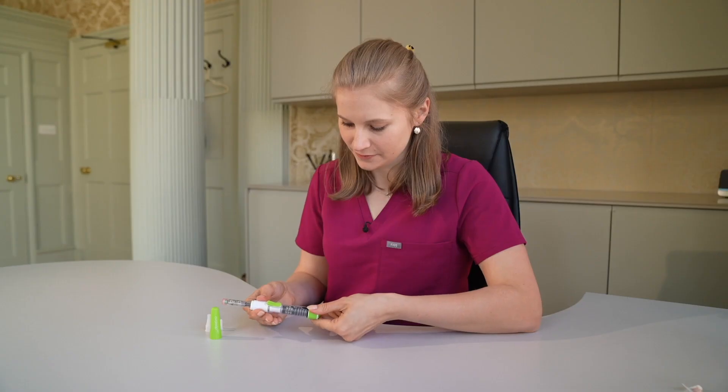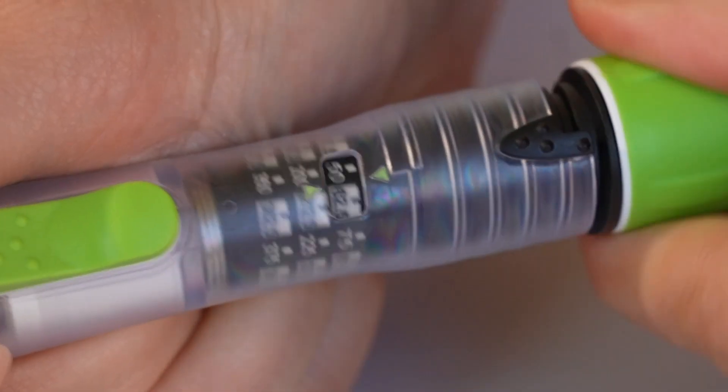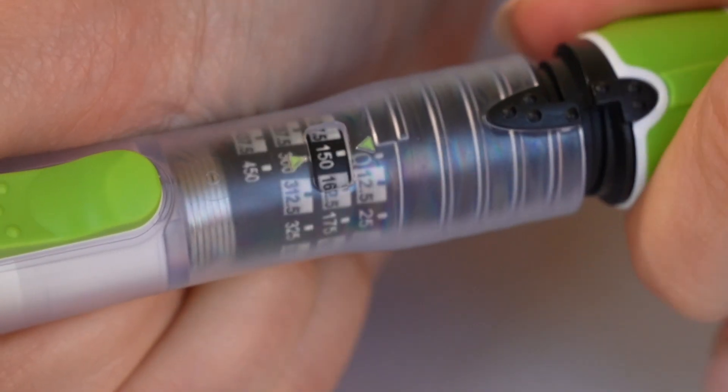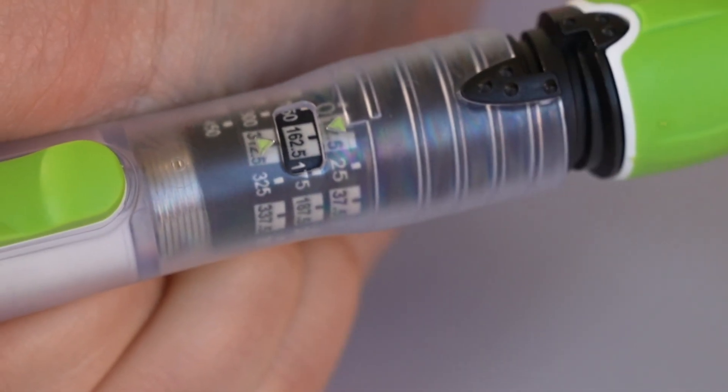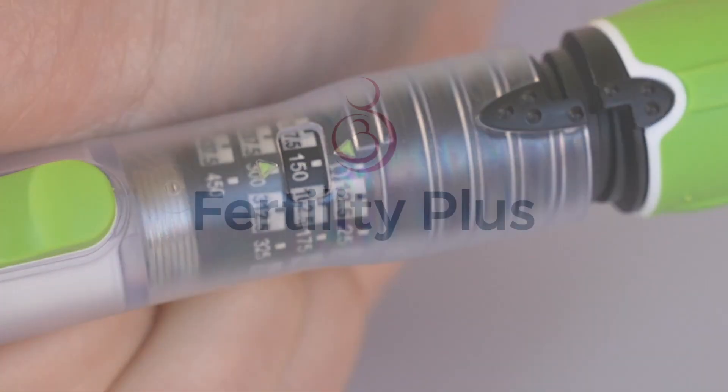Now we need to set the dose. Twist the green top of the pen whilst looking at the display of the dosing window to ensure you set the dial to the dose you've been prescribed. Don't worry if you move the dial too far — you can press the top of the pen to reset the dose. I'm demonstrating 150 units.